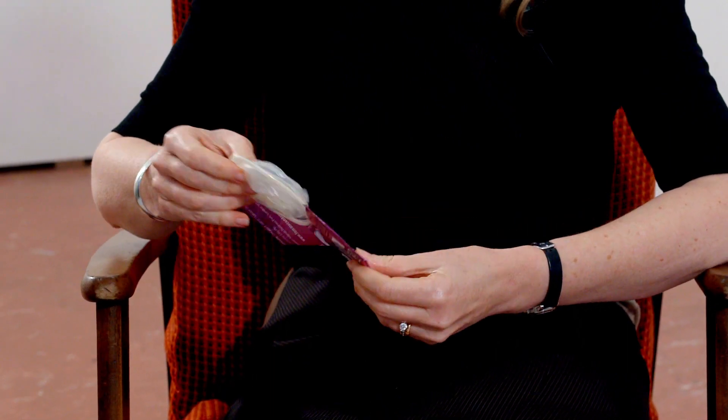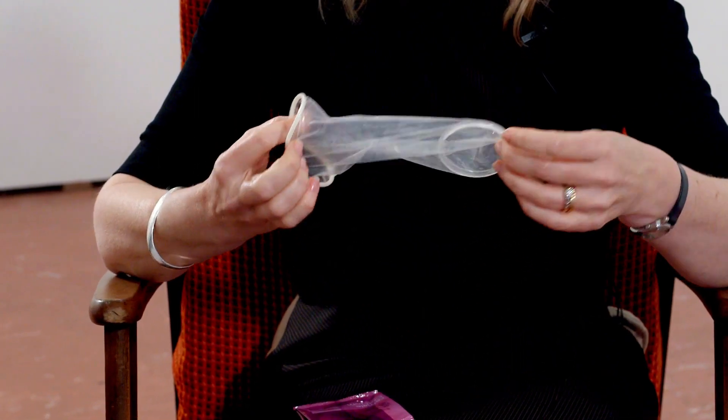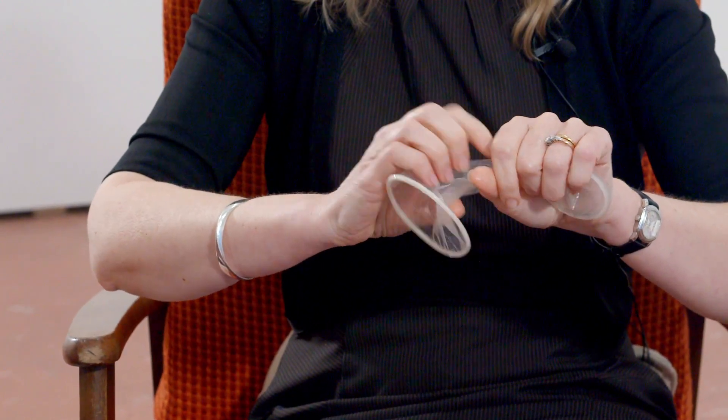With the female condom you'll see that it has two rings — an outer ring and an inner ring. It's well lubricated, so all you need to do is squeeze the inner ring together and push it into the vagina as far as it will go. The outer ring stays on the outside.